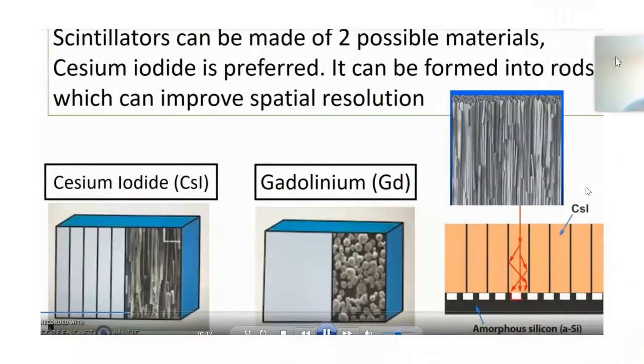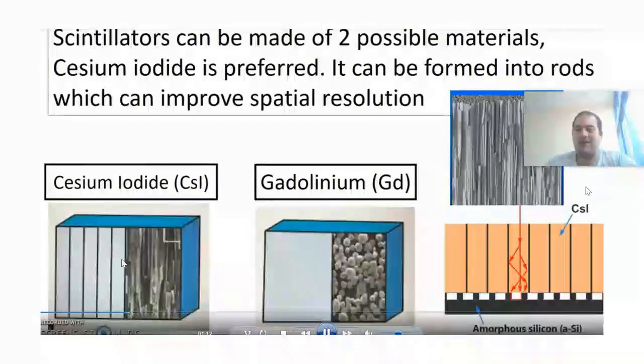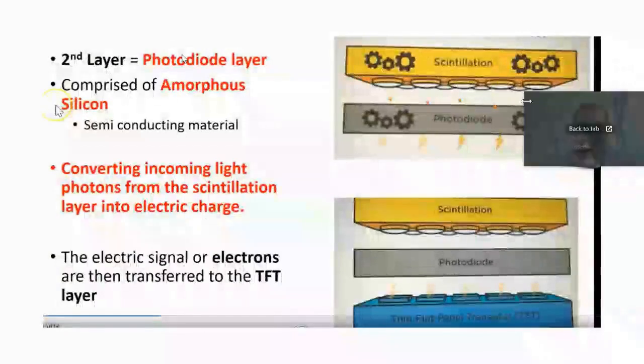This is what led to the idea of having two types of scintillators, like cesium iodide, where the paths are clearly defined so that you can determine the path of the light, unlike the other type. You will find it available, but just so you know the type, there is one that is a bit more expensive. Of course, this will be better for you in the imaging part.